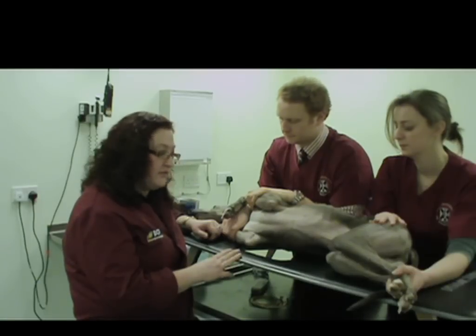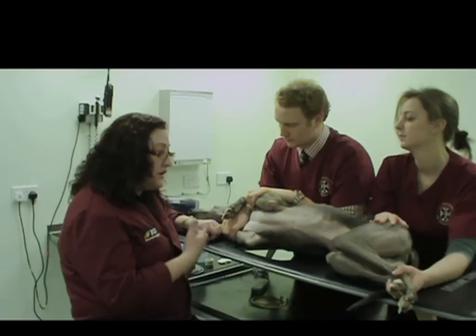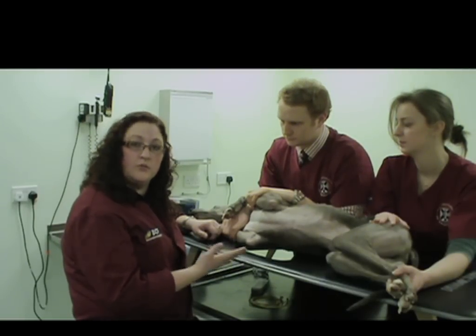Another thing you will be able to see is a pericardial effusion. All of these things are very useful to give you a good starting point to know what's going on with the animal diagnostically.